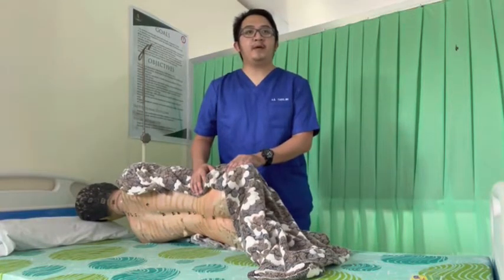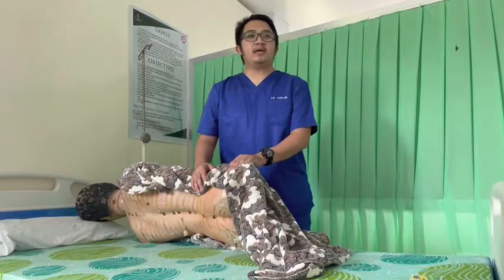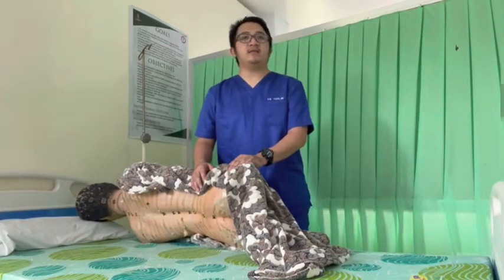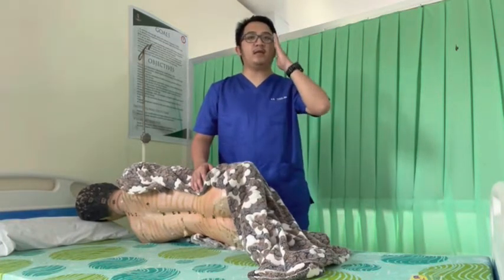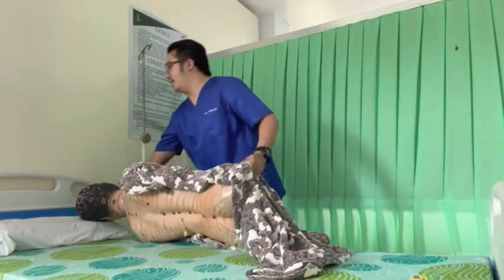A small pillow may be placed under the patient's head to maintain the spine in a horizontal position. A pillow may be placed between the legs. This is because movement of the patient could produce trauma to the spinal cord area.